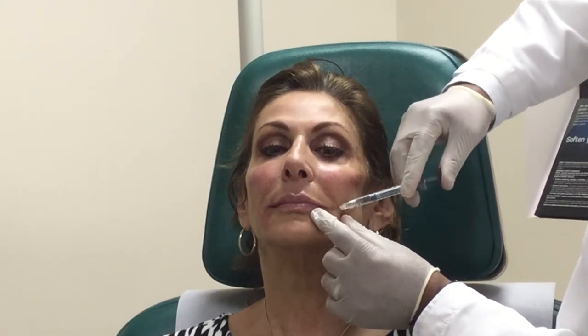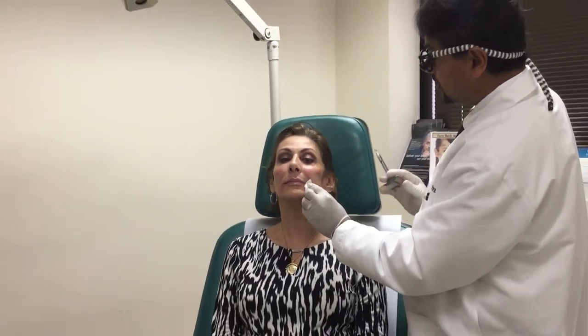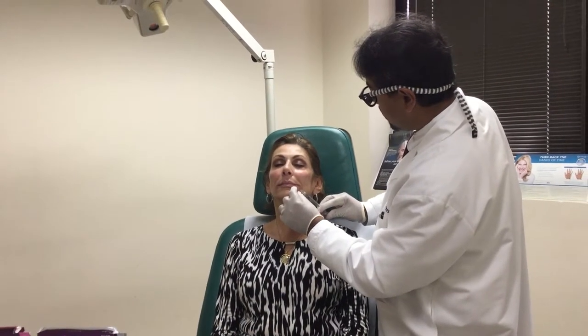Often patients will ask, does this hurt? We are placing a needle to inject these, so it can be a little bit stinging, and each patient tolerates it differently. People who've had it a number of times are usually able to handle it well and not react to the soreness as much. Other patients have a little harder time with it, but generally it's pretty well tolerated. With the topical numbing creams that are available now, they actually work pretty well so that you can even inject lips and such without too much discomfort for the patient.